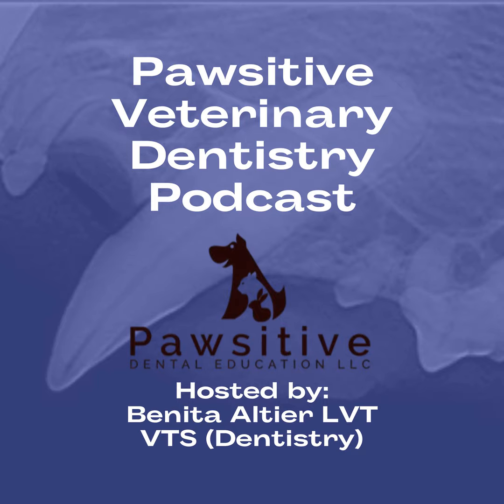I would say before we even talk too much about interpretation, we really should talk about image quality. I don't want veterinarians, and I'm sure you don't either, to start interpreting images that are not even of diagnostic quality. So could you further define what they should be looking for before they start interpreting, in regards to whether this image is diagnostic quality, or whether I should have my technician take a new image that would better show the realistic appearance of the teeth and the bone that I'm looking for?